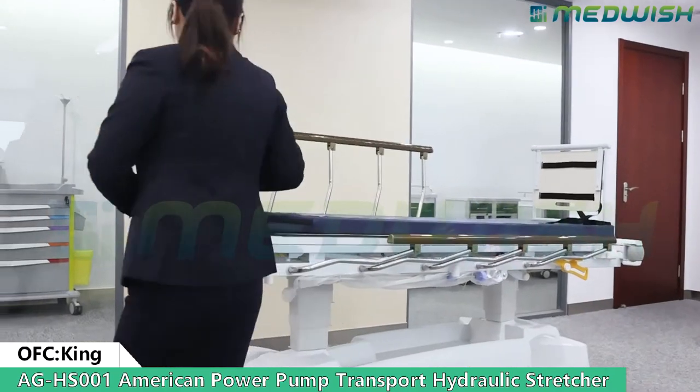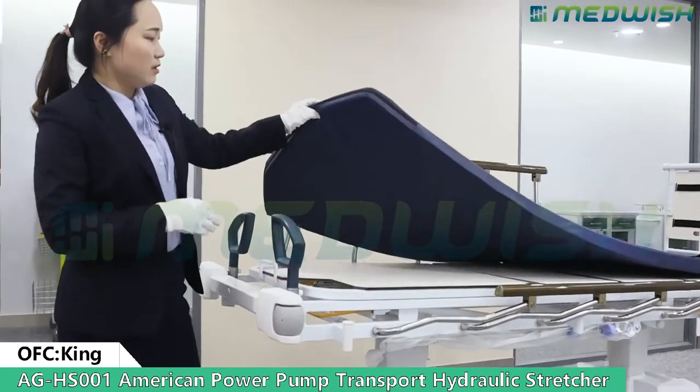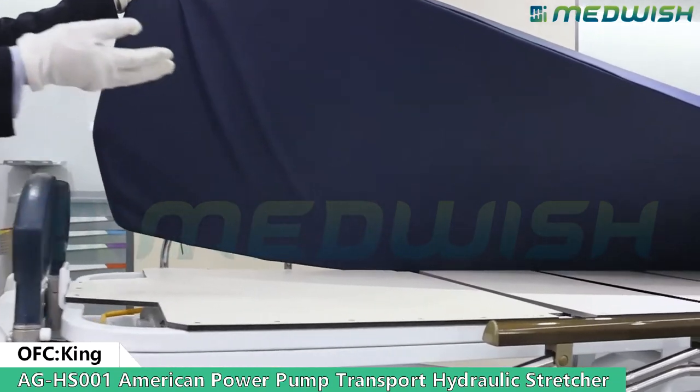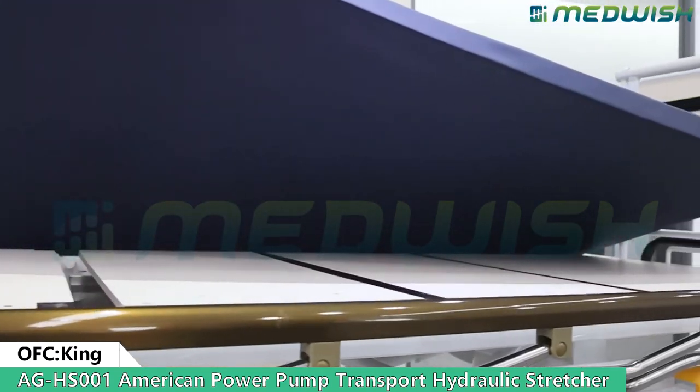For this part, the bed board, it is an X-ray translucent bed board. You can use it with your C-arm X-ray.